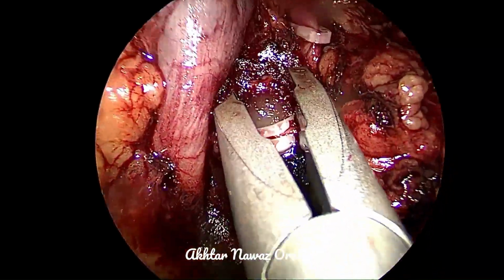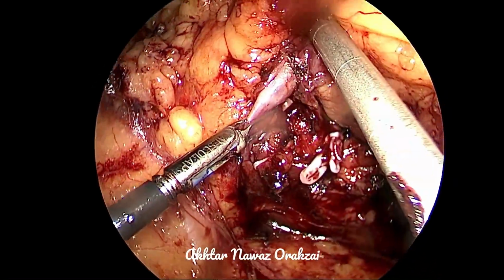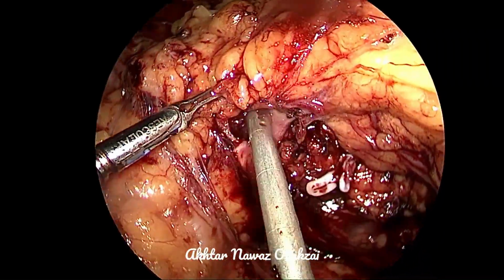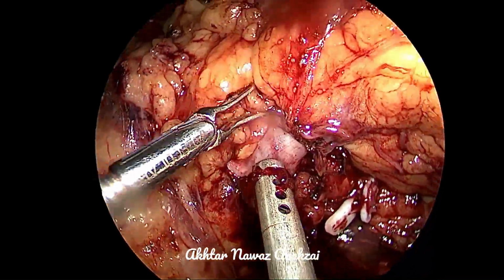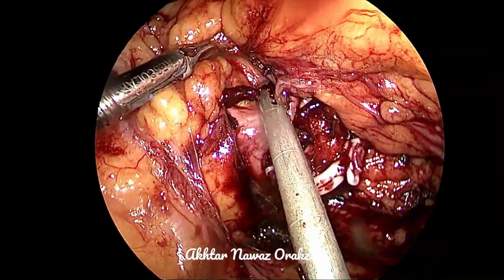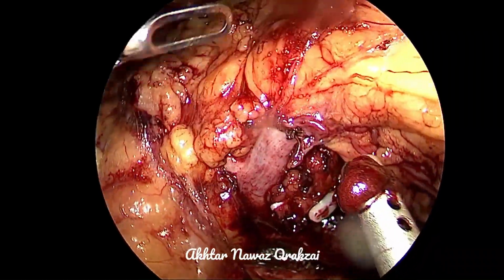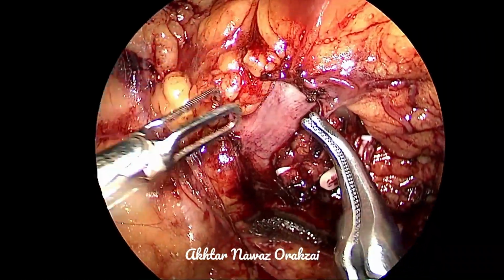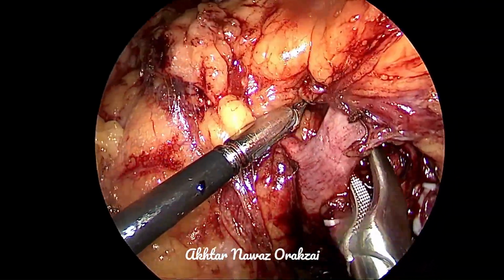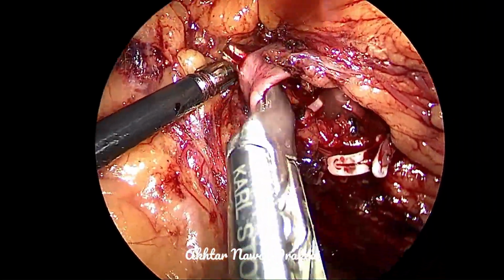However, since we have to cut the vein first, because it is anterior to the artery, we clipped the branch as well, and then we saw that the vein has collapsed. The pressure within the vein has reduced, and we are now easily able to dissect it. So the posterior surface of the vein remains, for which the right angle is the best gadget.